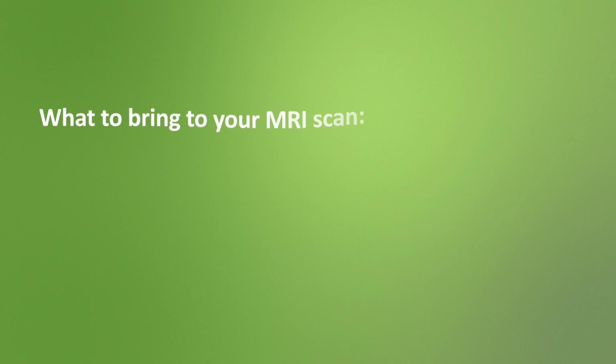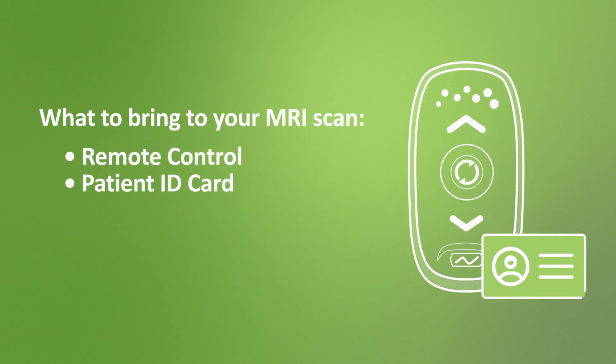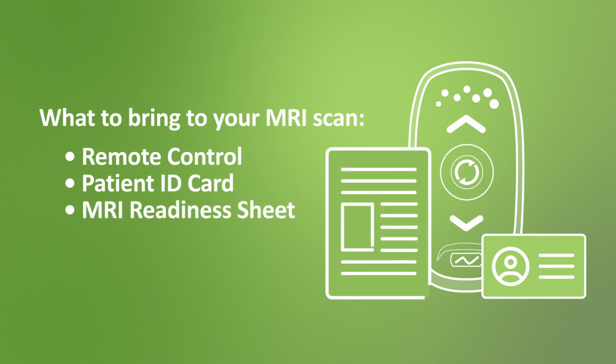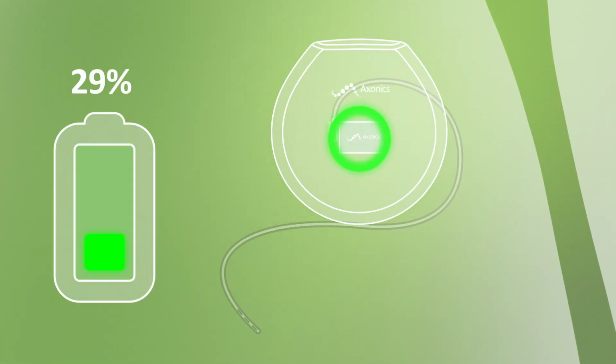It's important to remember to bring your Axonics remote control, your Axonics patient ID card, and the MRI readiness sheet your physician provided after your implant. If you can't find your MRI readiness sheet or you need a new one, call your Axonics clinical team member and they can help you. If you have a rechargeable stimulator implanted, we also recommend charging your stimulator before going to your MRI appointment.